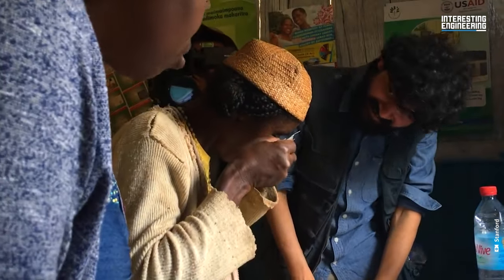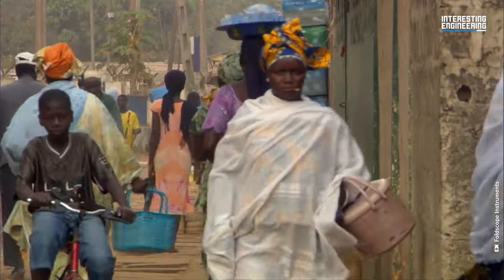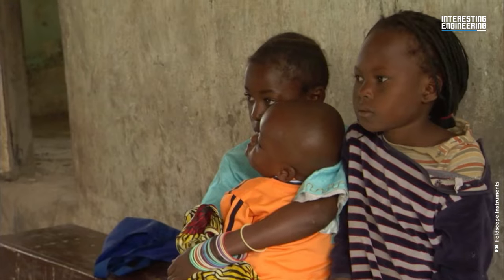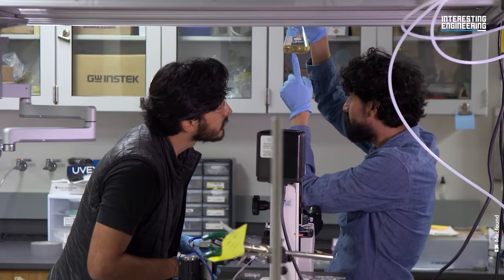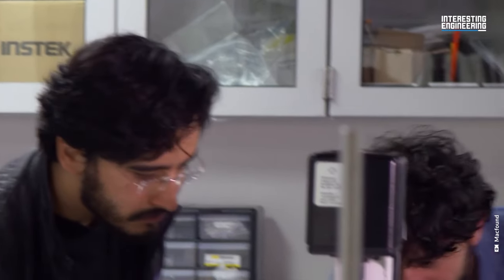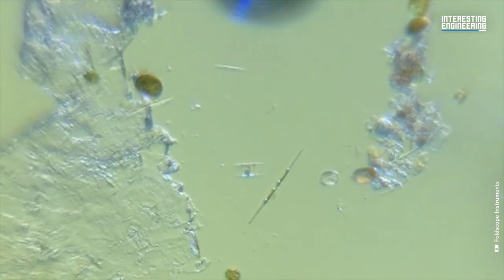Prakash and his colleague Saad Bhamla even went to Madagascar and brought their paperfuges to help health workers and conduct a paperfuge field validation trial for malaria diagnostics with various community health collaborators based in Madagascar. This is the third invention from Prakash Lab.